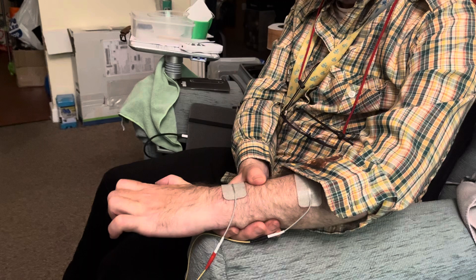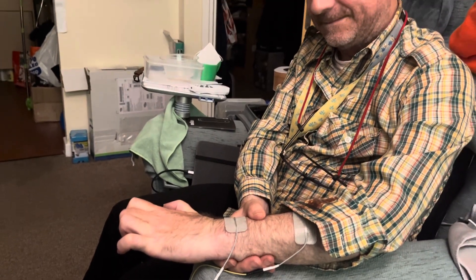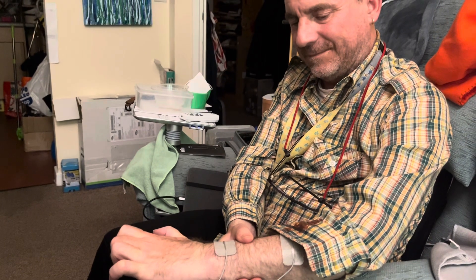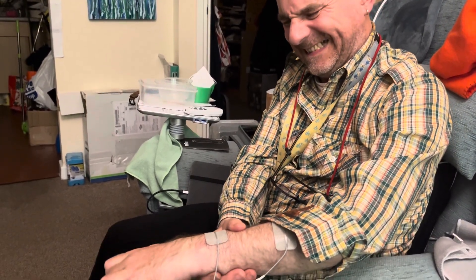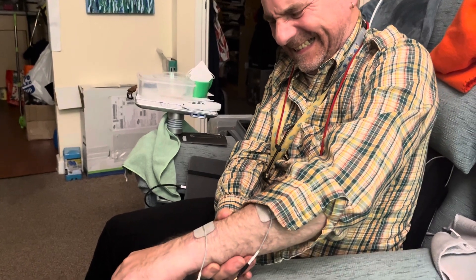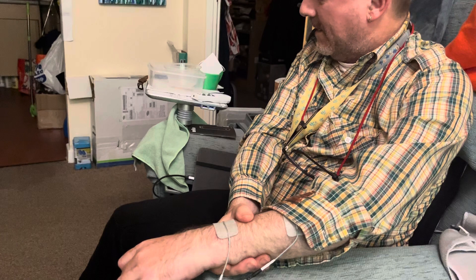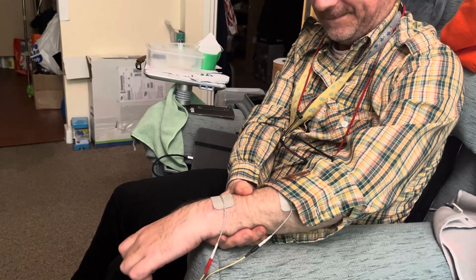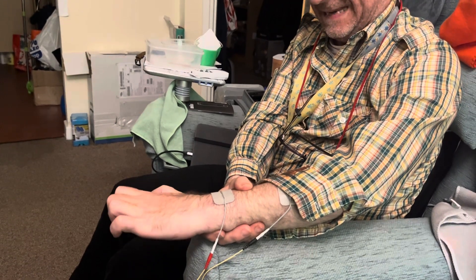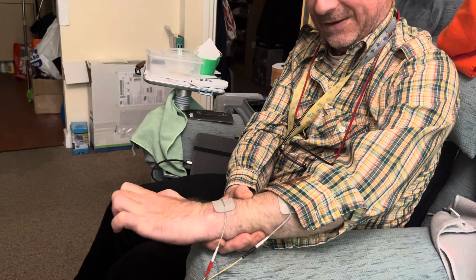Ready — there we go. I'm trying to send the same signals with my brain as well, so you've got to kind of concentrate. And then when it relaxes, I try and close my hand. I'm struggling to do it. Get ready.